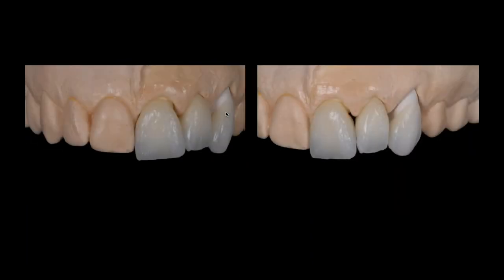So here's again, a first bake. This is a full contoured central, meaning it's a full buildup with 12 powders or however many I use. The lateral is almost monolithic. I'm just layering on the facial with only 3, 4 powders, and the cuspid is actually a window veneer. So this was another course model from a few weeks ago somewhere else.